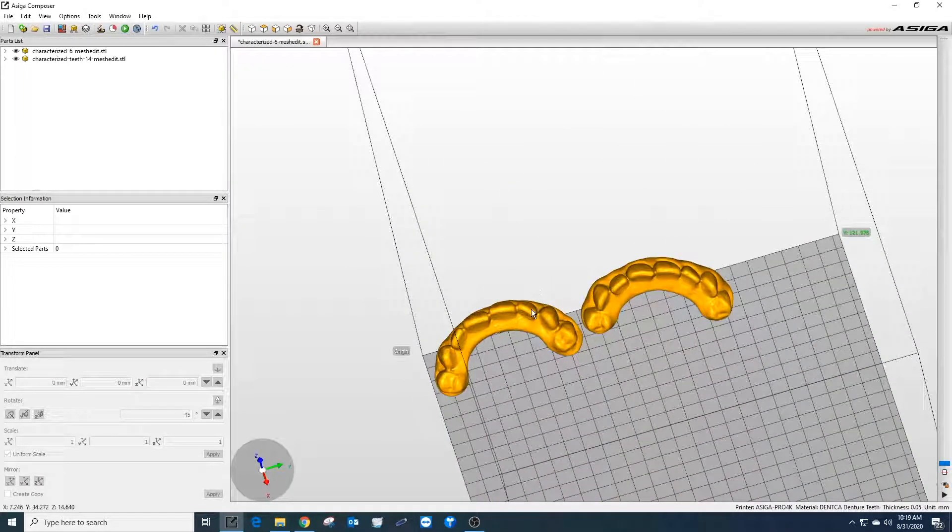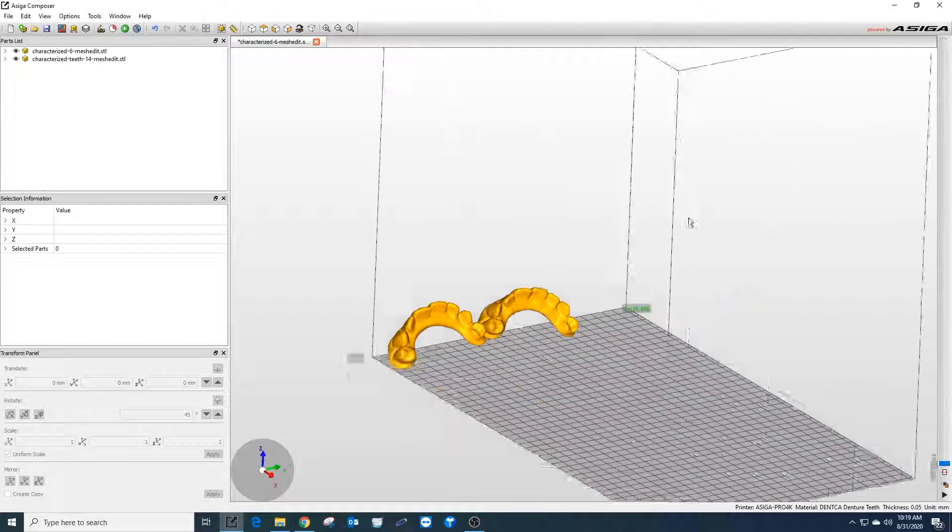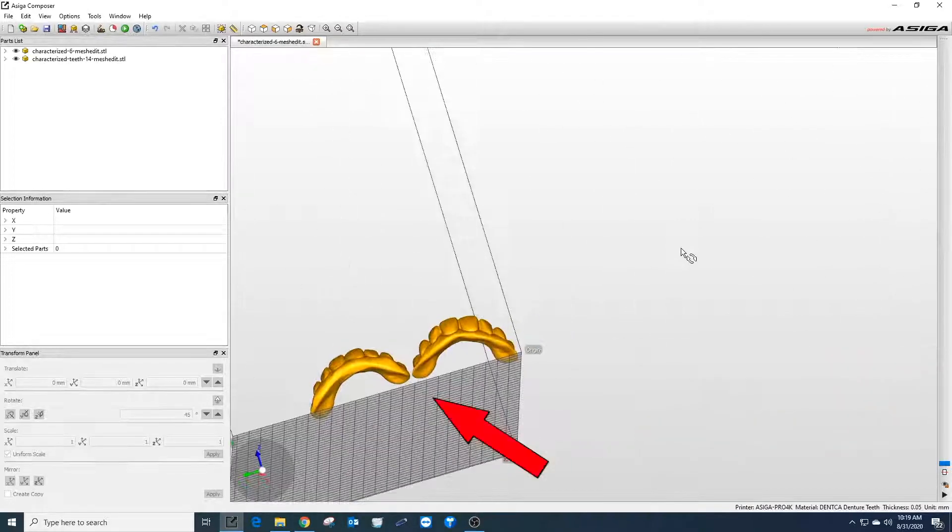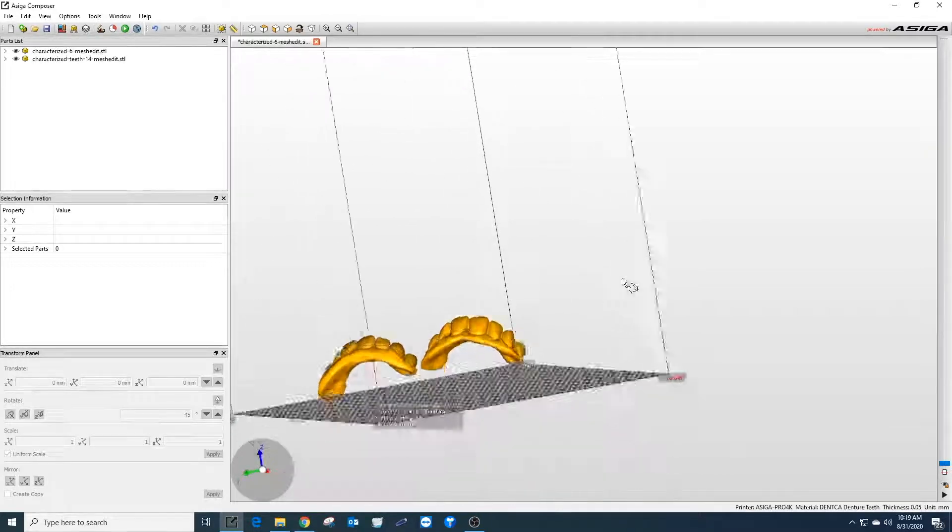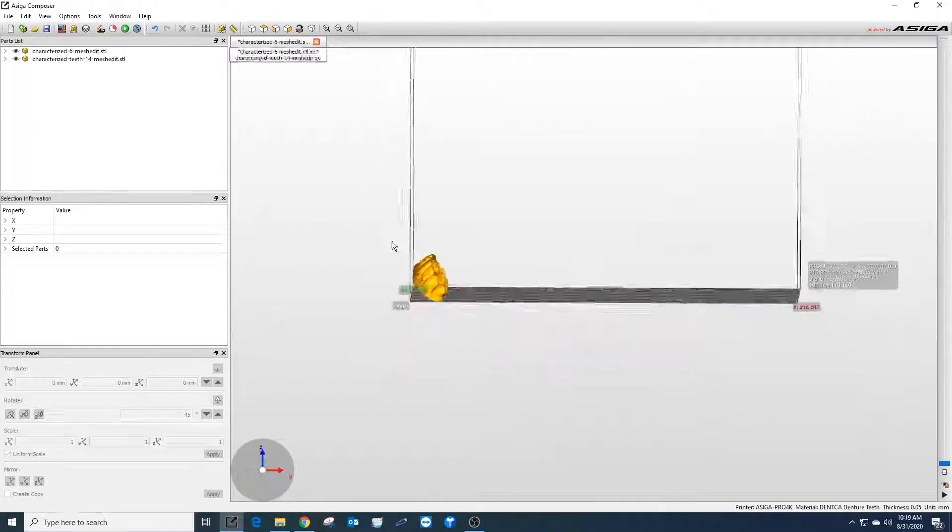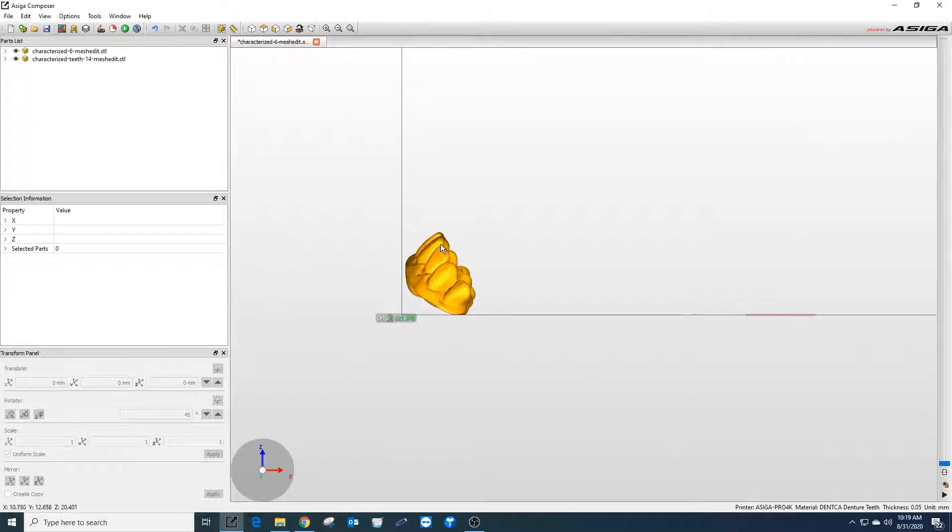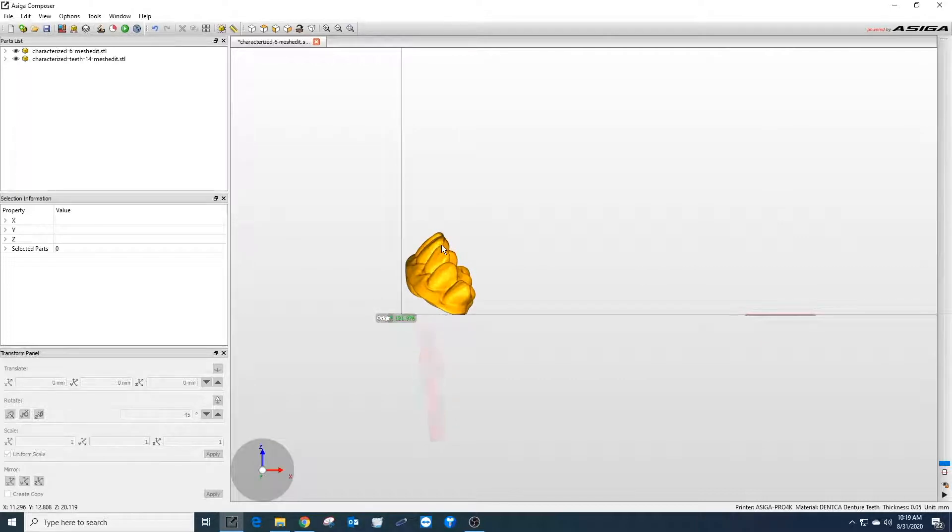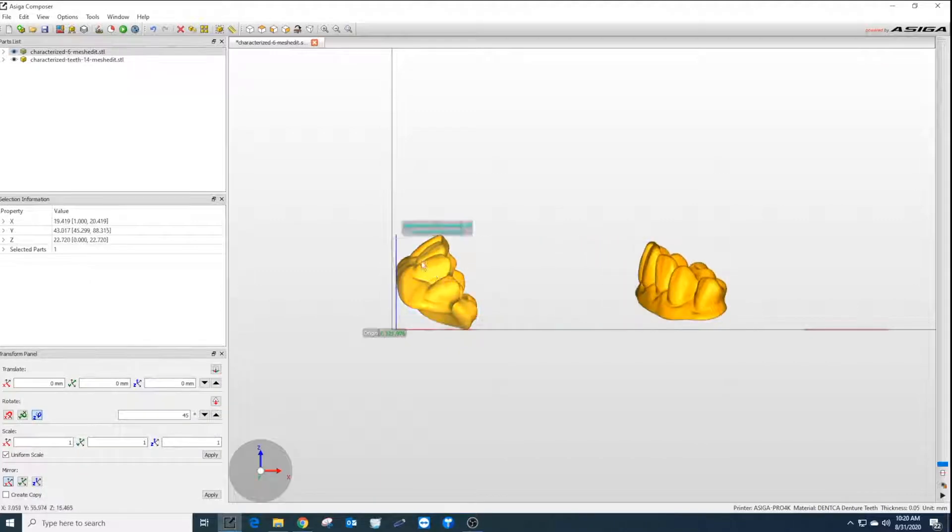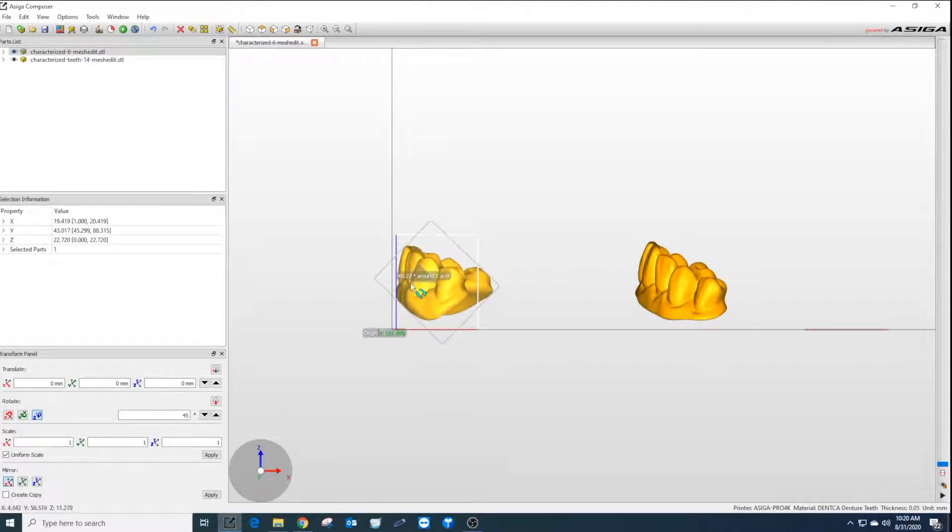If just for characterization, the supports for the print can be placed on the underside of the teeth. If printing to use for a patient, it's better to print the supports vertically on the anterior region of the teeth. Next, place the teeth so they are horizontal to the build plate with the teeth facing up.